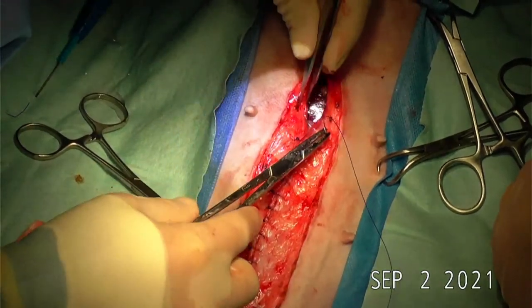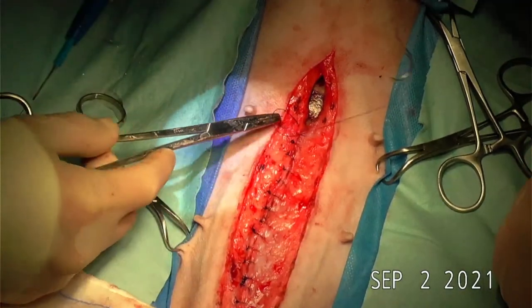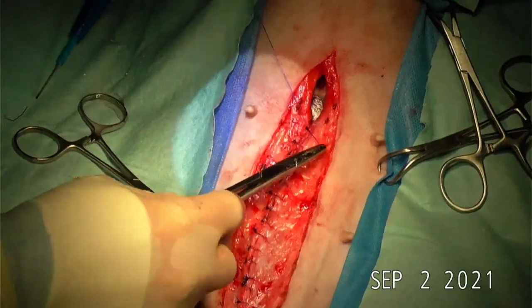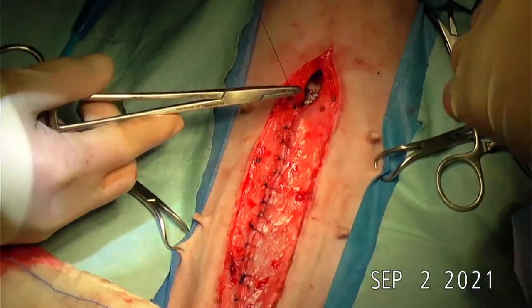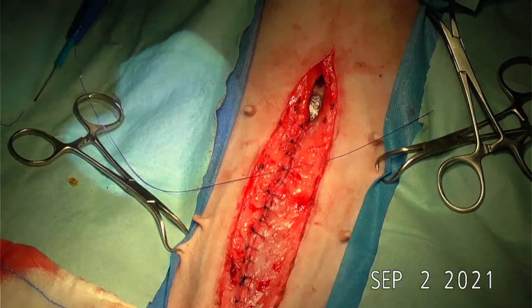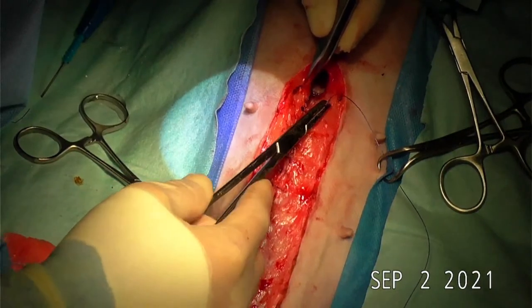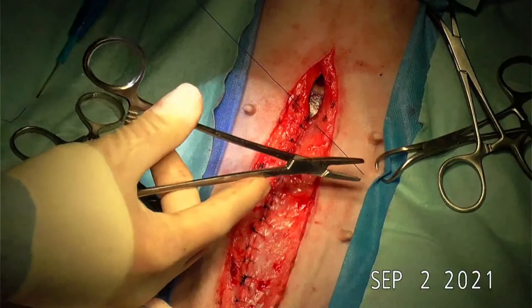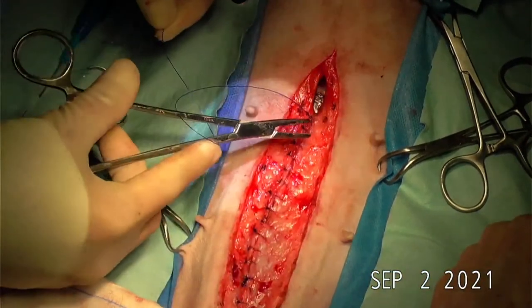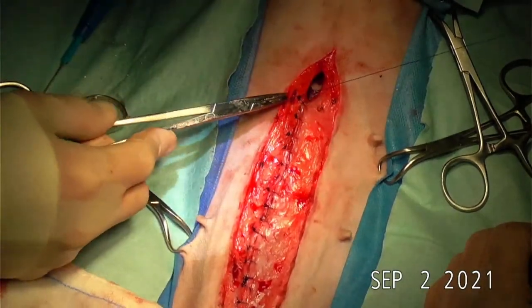Tama-tama lang size. Yung CT2, para pareha yata yan, iba lang ang PDO, pero the same material, different manufacturer, and different quality. Siyempre PDS is the standard when it comes to polydioxanone suture.